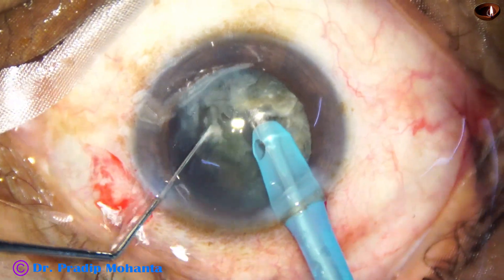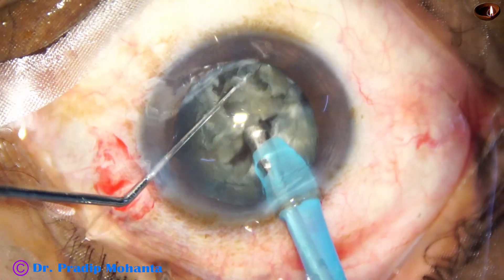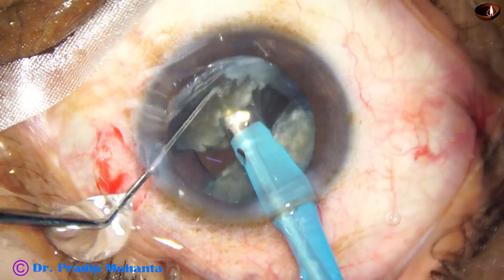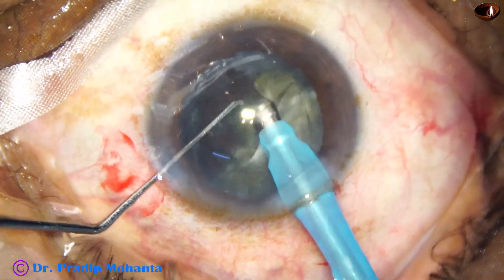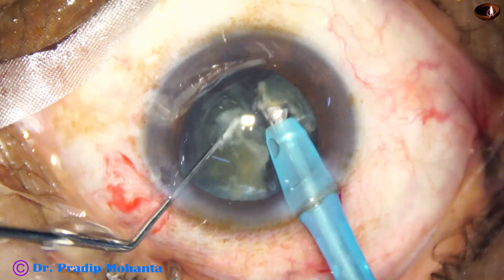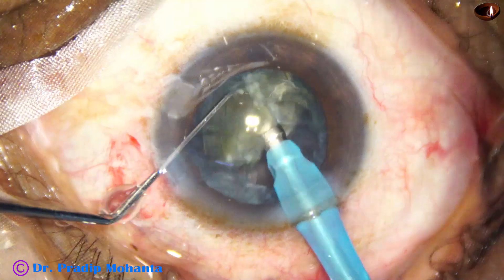Now each hemi-nucleus is subdivided with the phaco needle into two large fragments, and then each large fragment is emulsified. If necessary they are divided into smaller fragments. I am detaching the epinuclear shell — this epinuclear shell is protecting the posterior capsule. Coming to the other hemi-nucleus, I detach the epinuclear shell, get only the nucleus, and emulsify it. In this way we can protect the posterior capsule very effectively.